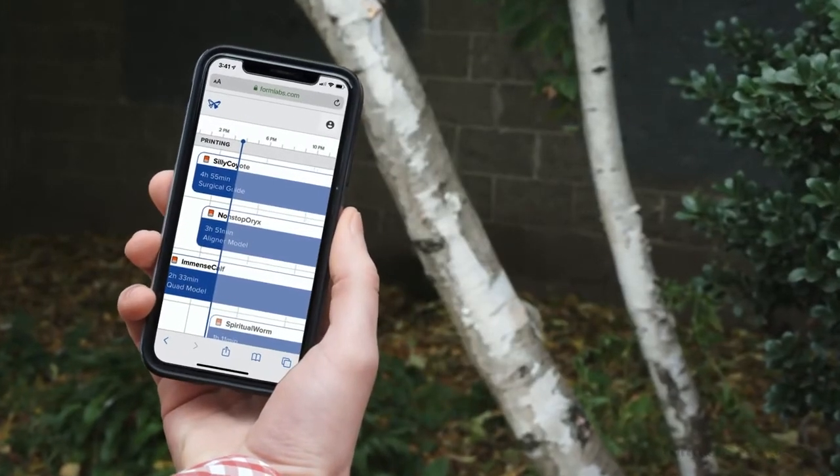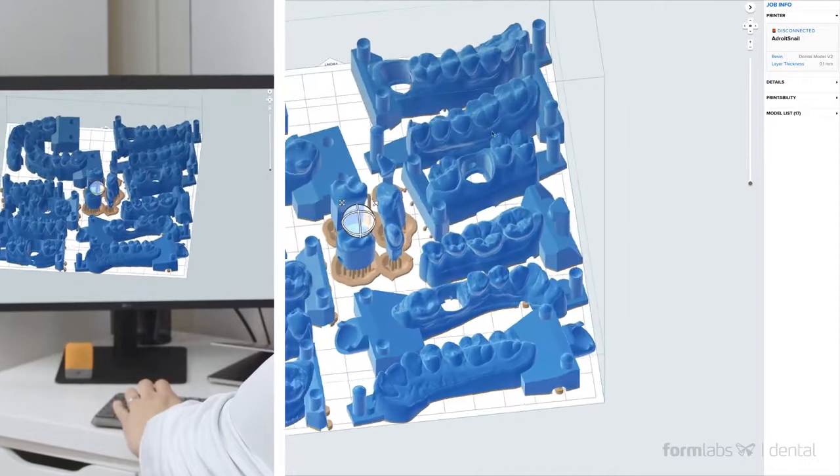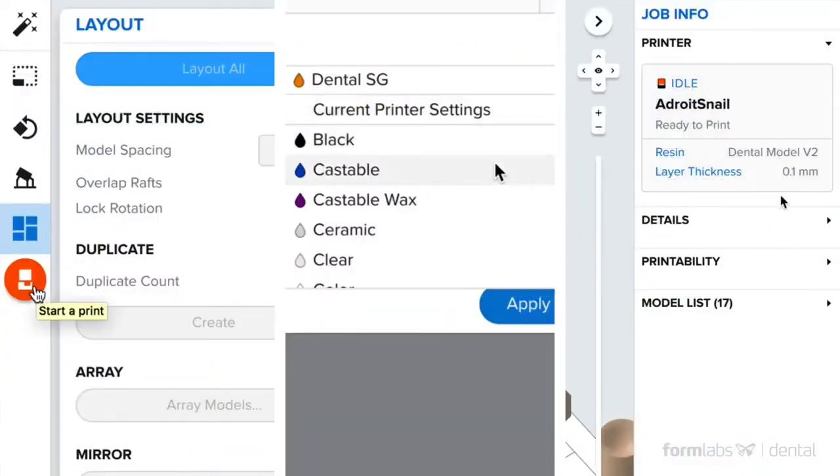Remote print allows you to initiate and monitor prints from anywhere, with user-friendly PreForm print preparation software that integrates seamlessly with existing imaging and CAD-CAM solutions and full independent control over settings and materials.